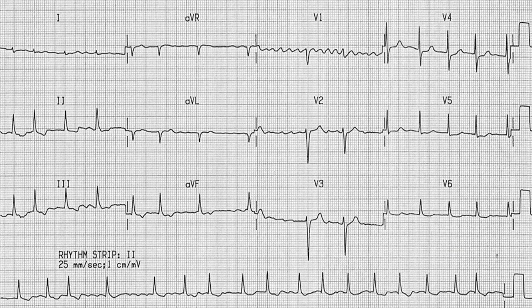Okay. Now this rhythm strip, we want to see if it's regular or irregular. Well, as I was saying, that can give you the speed. It tends to be on the ECG paper, so look at the speed of the ECG. Pick 3 QRS complexes, mark your points, 1, 2, 3. Now slide the paper to this point and see if they match. You can see that they don't match, so no QRS complex is there, so that makes it irregular. So that's an irregular rhythm.